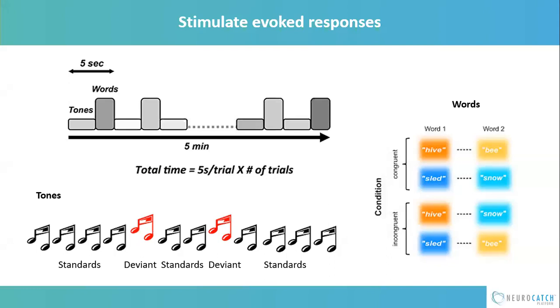All right, so we left off on last boot camp really talking about the fact that from the EEG, we do signal averaging to extract evoked responses. And critical to NeuroCatch is to understand evoked responses mean you need to stimulate the brain. You can kind of think about it like you stimulate and look for a response, similar to like a knee-jerk reflex sort of thing, except at a neural level. So this slide is dedicated to helping you understand how we stimulate the brain.